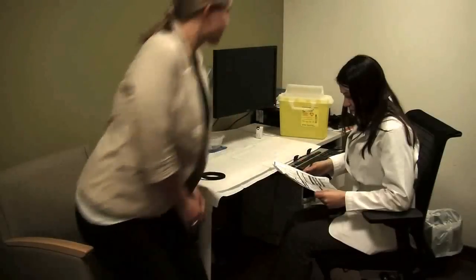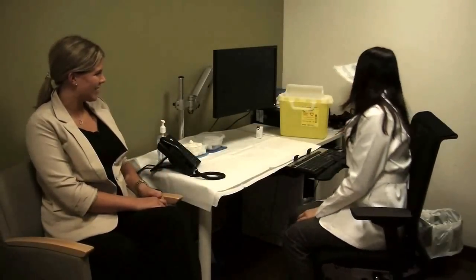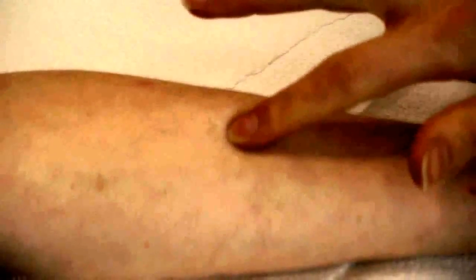When the client returns for their TB reading 48 to 72 hours later, inspect the skin under good lighting and palpate for induration. When assessing the size of the reaction, be sure to measure the induration, not the redness.